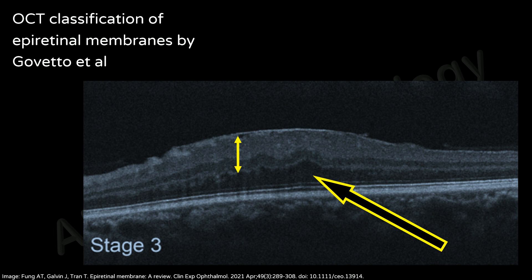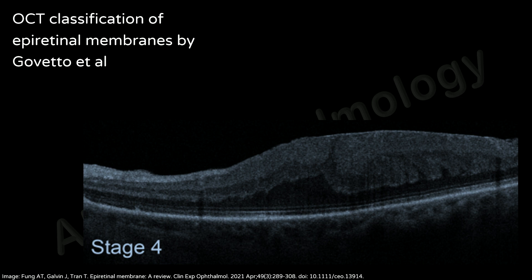Stage four is defined as an ERM complicated by significant retinal thickening and remarkable anatomic disruption of the macula. Continuous ectopic inner foveal layers are present. Retinal layers are noted to be significantly distorted, disorganized, and not clearly identified with OCT.